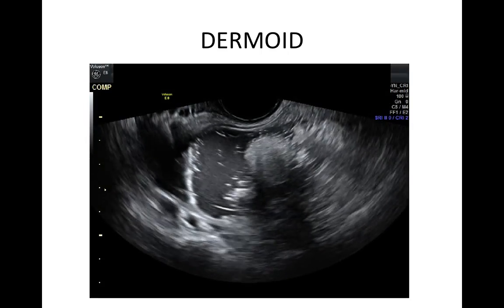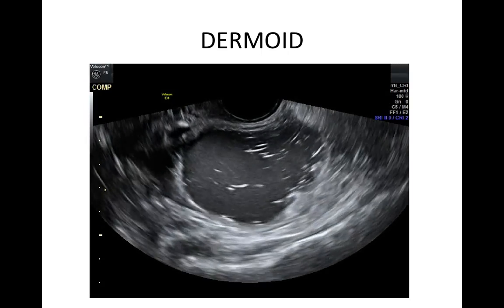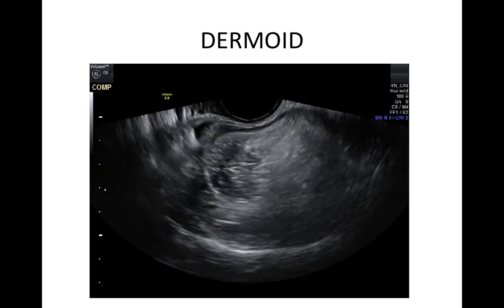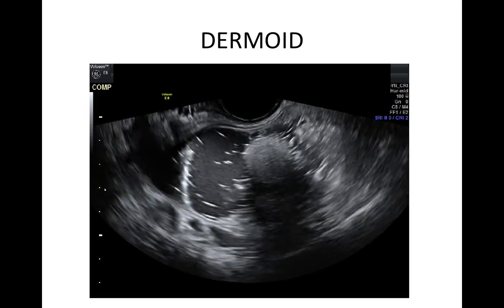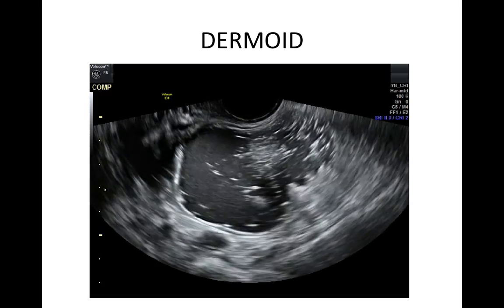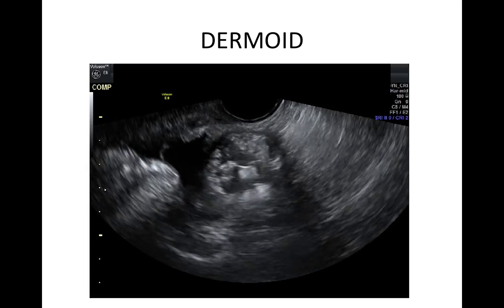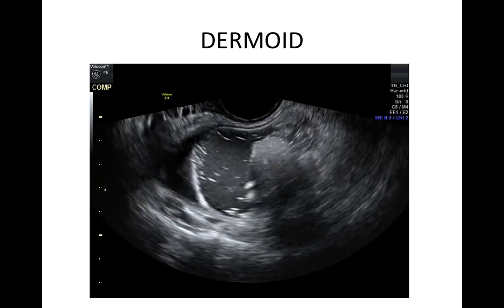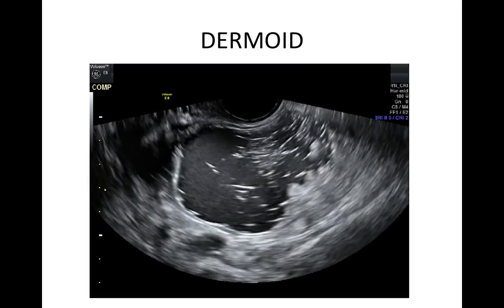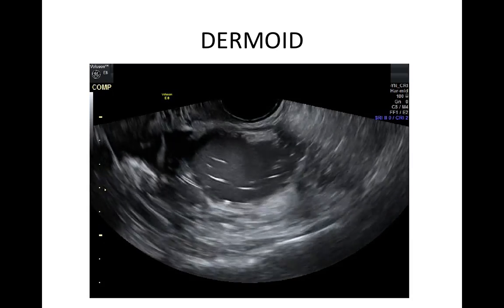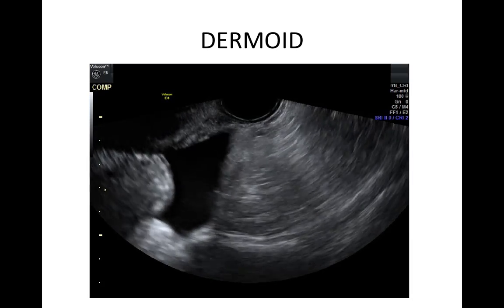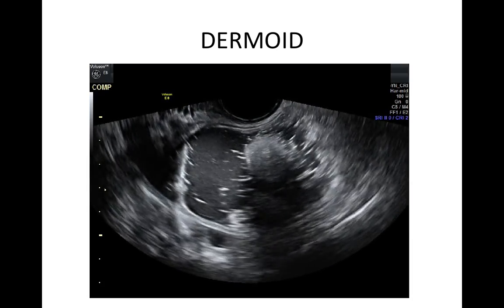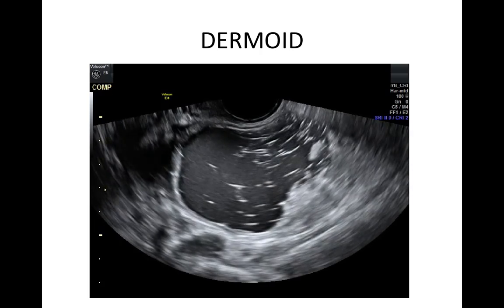A dermoid or mature cystic teratoma is typically a unilocular cyst with no solid material. The white ball or Rokitansky nodule does not count as solid material. There is mixed echogenicity with some bright echoes, dense shadowing and minor vascularity. The fine lines are typical of hair floating in sebum. Posterior acoustic shadowing can be dense due to the presence of bone or teeth.